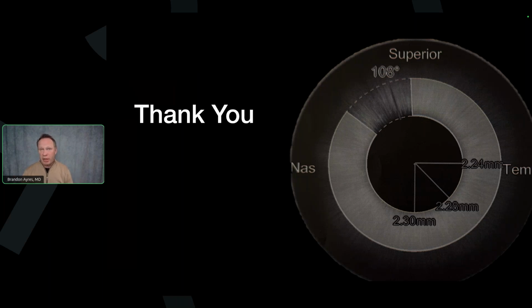I'm very excited about epi-on collagen cross-linking. We have 50-plus patients already enrolled in the portal, and if you ask a patient what was worse, your CTAK or your cross-linking, hands down, cross-linking is worse. Epithelium off, it hurts for a couple of days. With CTAK, you get to the end of it and they're like, wait, you're done? And they go home and say, I can see different the next day.